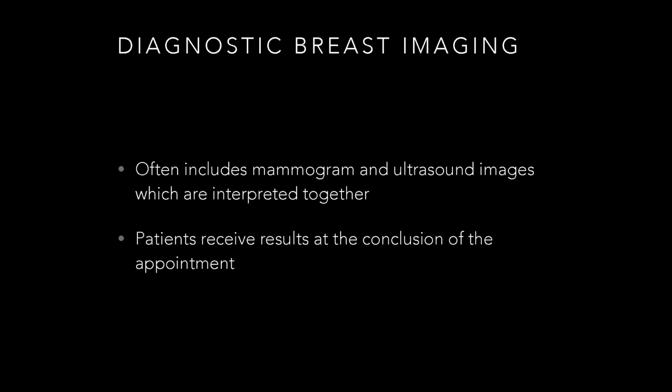And as I mentioned before, diagnostic breast imaging often includes mammogram and ultrasound images interpreted together, and the patients will receive those results at the conclusion of their appointment.